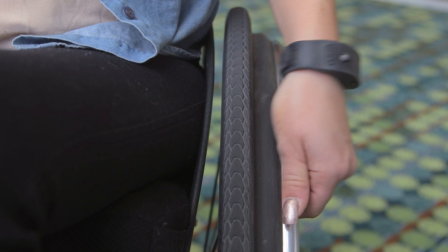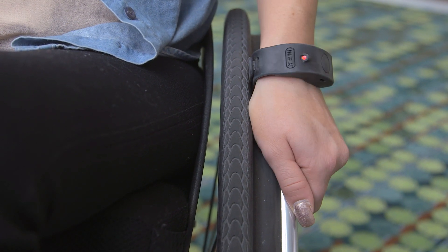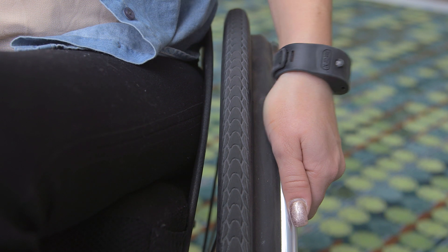If you're already braking on the push rim, you can tap without letting go. Just flick your wrist to shut off the motor.